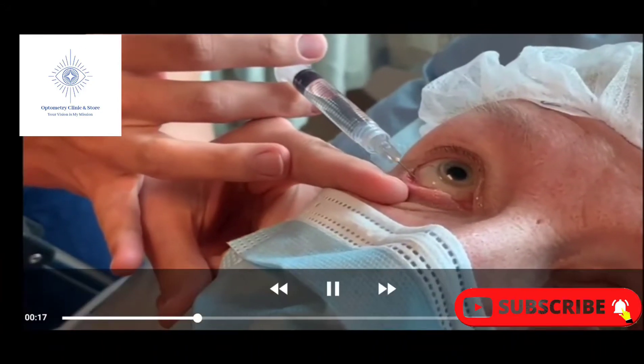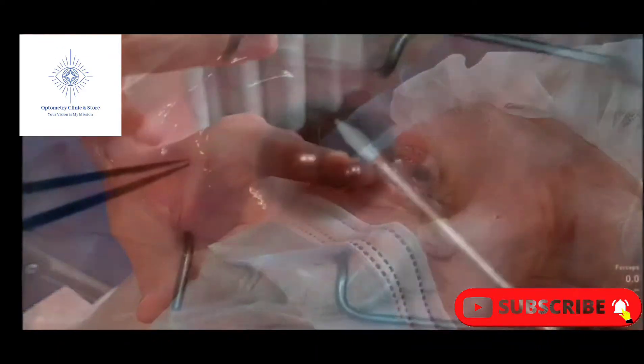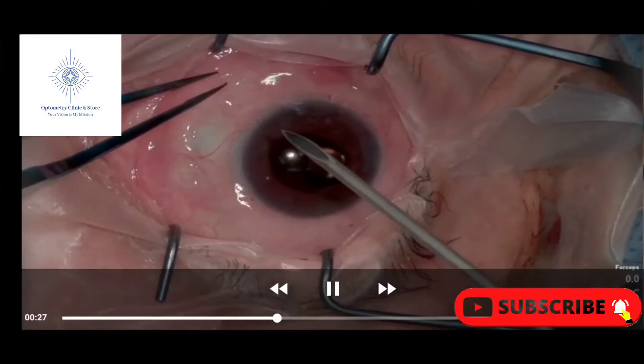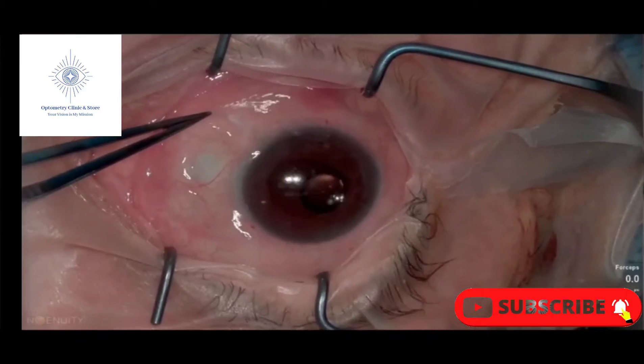The patient has been administered subconjunctival freezing before entering the OR. The conjunctiva is lifted 5-10 mm from the inferior nasal limbus, and an 18-gauge needle is used to puncture the conjunctiva to create a pocket under Tenon's capsule.